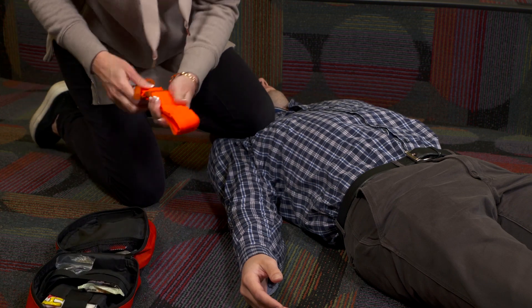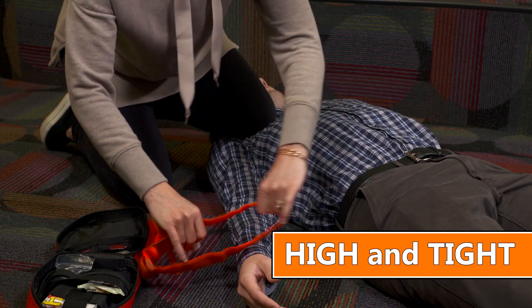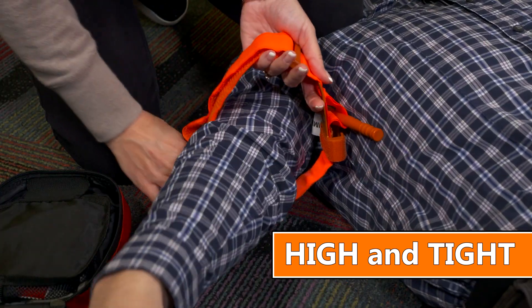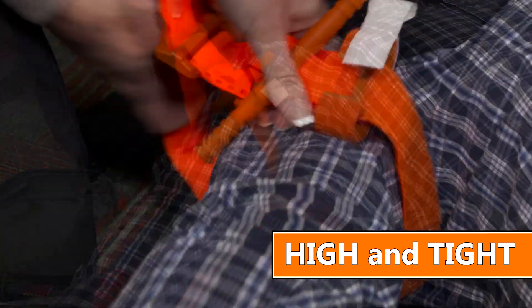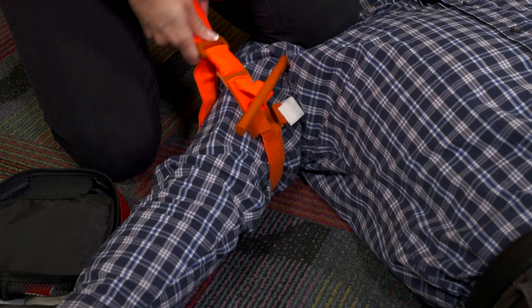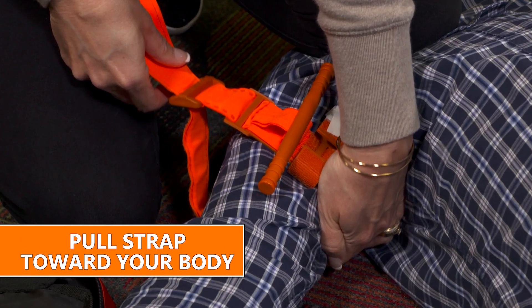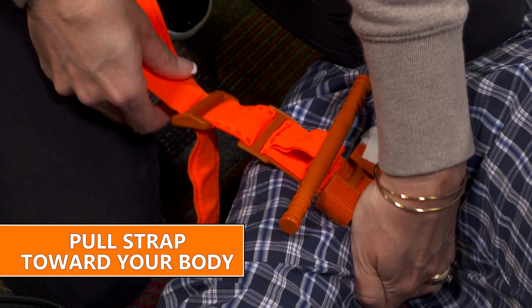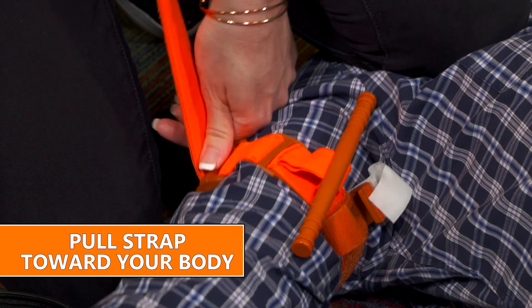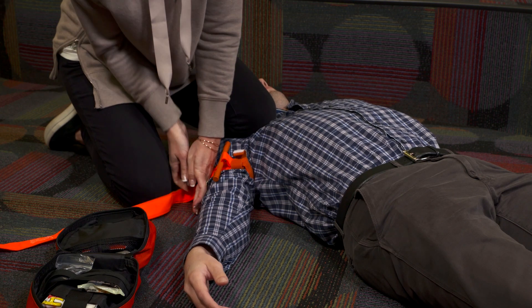First, apply the tourniquet high and tight — place it as high up on the bleeding limb as possible and pull the strap as tight as possible. Second, when pulling the strap tight, it is advantageous to orient the strap and buckle so you're pulling it towards your body, as you can generate much more power and force pulling towards you than pushing away from you.